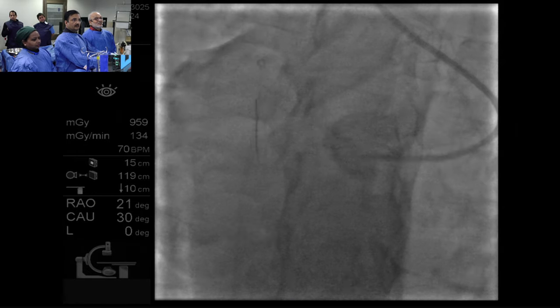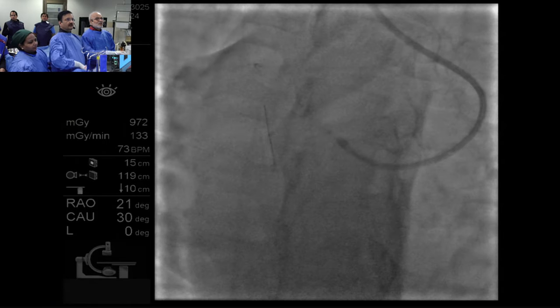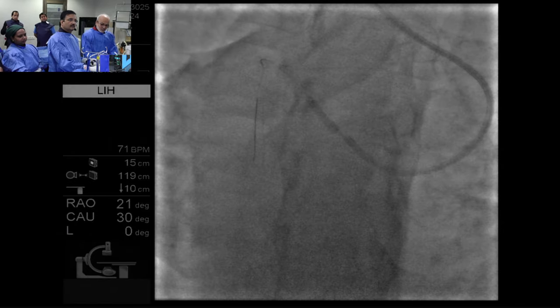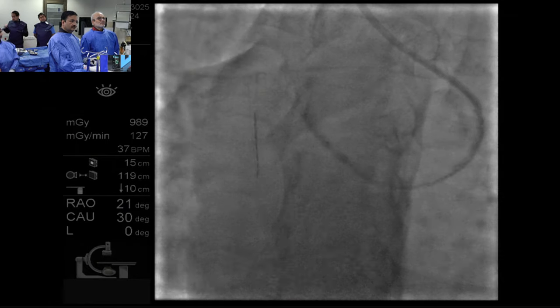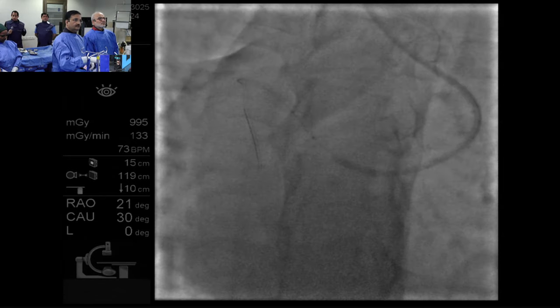As a panel, with the increasing use of the IVL, have you seen a decrease in perforation of the coronary, or do you think it has increased? Actually, that's a great question, and I don't want to jinx myself because I'll go home and cause a perforation, but it seems like it's less. Is it because we are simultaneously using more imaging, or is it because of IVL? Very hard to separate that out.